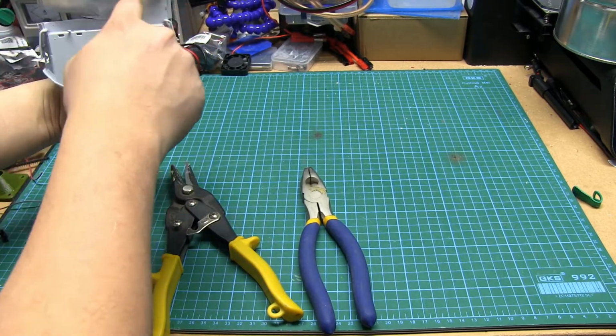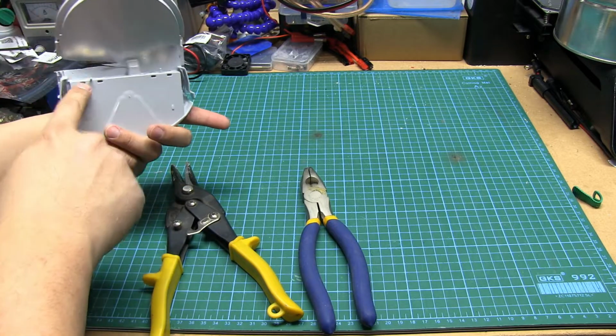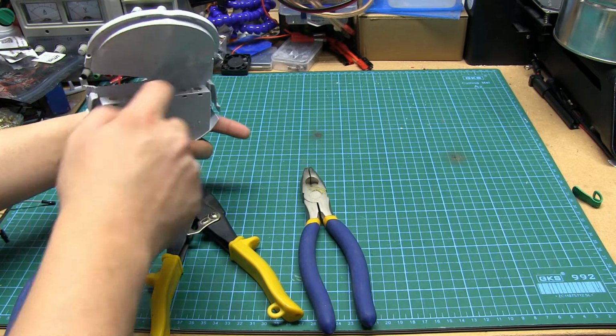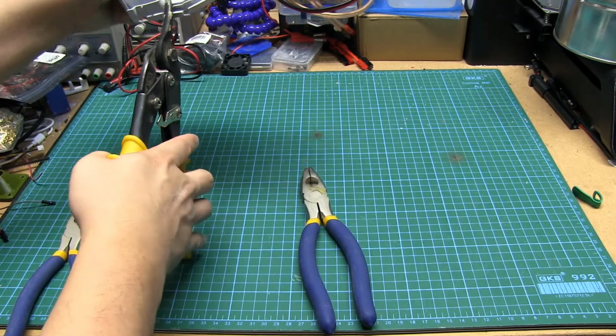Now, as I get a little closer to this section here, I want to be more careful. Oh no, I should have been more careful at the start because these are the two terminals with the voltage on them. Oops. Oh well, pay no attention. I'm totally going to remember to edit that out, right?